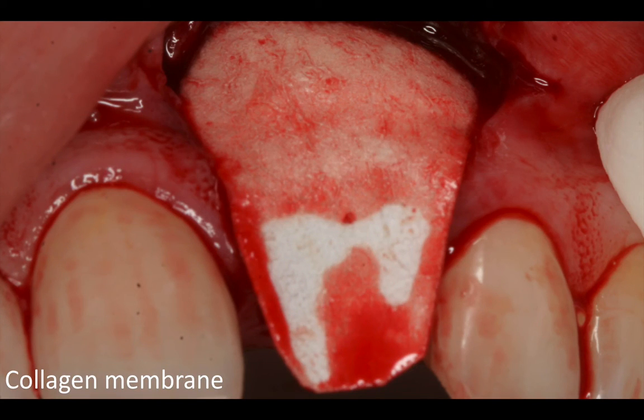And again, in hindsight, I now like to use a different method that is called the compartment grafting method, where I graft each part of the socket separately. So I would place a membrane only on the buccal surface to cover the defect, beyond the extent of the defect, and on the occlusal surface I'll place some type of collagen sponge or a PRF plug to keep both compartments, the buccal and the occlusal, separate.